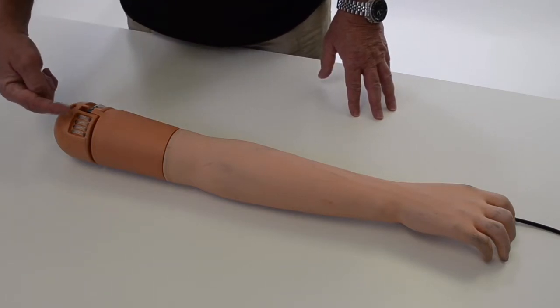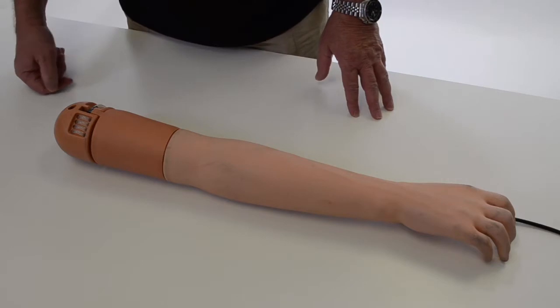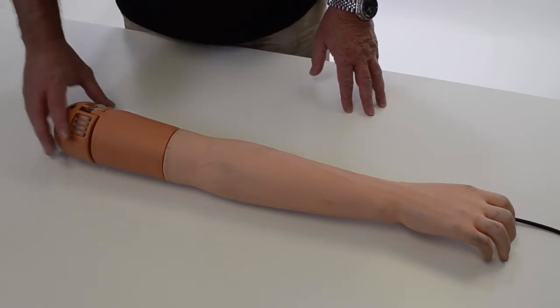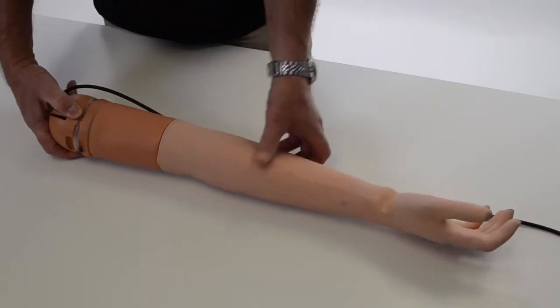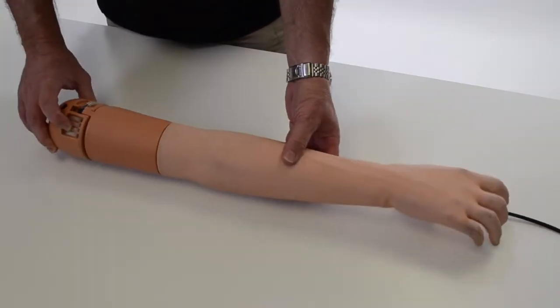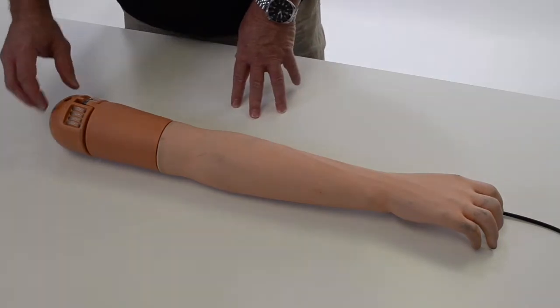So now we have the IV arm off. It's a four-channel arm: three of these channels are veins, one is an artery. The artery is the radial artery.